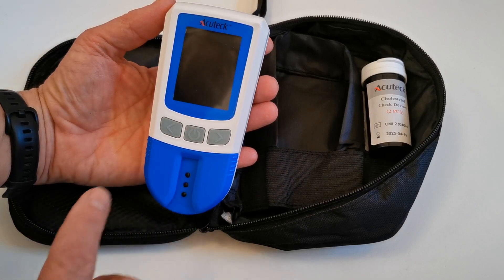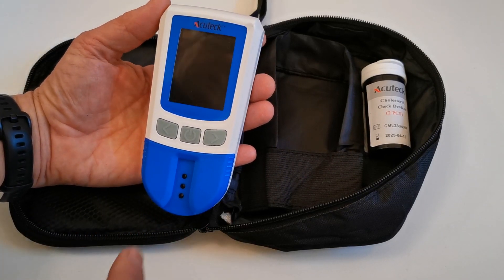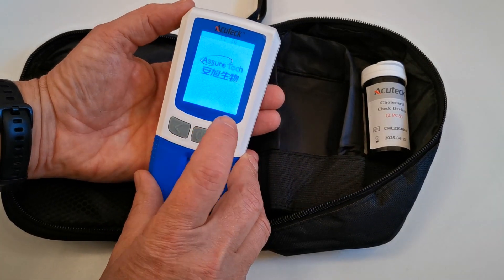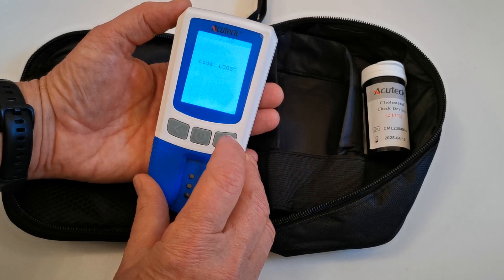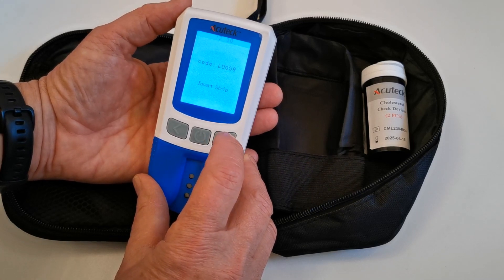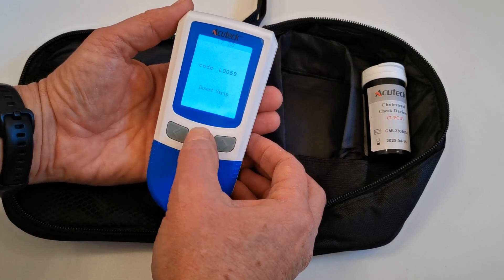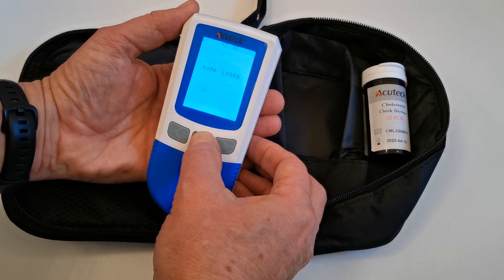Now, if you have not previously set the meter up, it will usually automatically go into mode for you to set the time and date. We're going to do that by pressing the power button, which is the central one of the three buttons on the front. This one has actually had time and date previously set, but I'm going to show you how to enter the mode to change that.